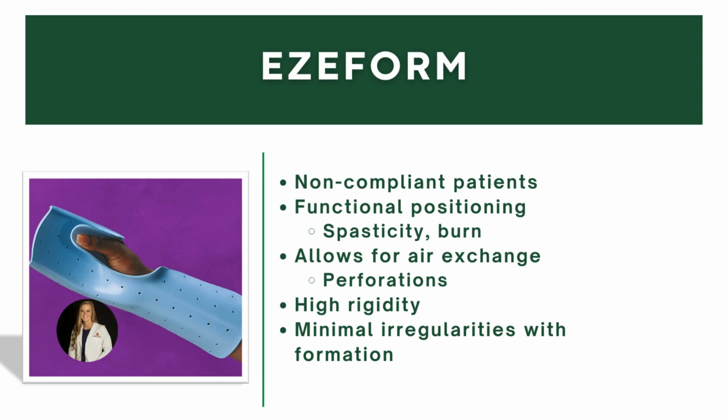And finally, we have Easy Form. So this is going to be ideal for patients who are non-compliant. The material can resist movement when conforming to the patient's hand or involved limb when you're trying to mold the material. So this is good for somebody maybe with spasticity, a burn, tremors, that functional positioning. Again, it does allow for some air exchange because of the perforation. So you can see those holes in the picture that allow for the skin to breathe a little bit.